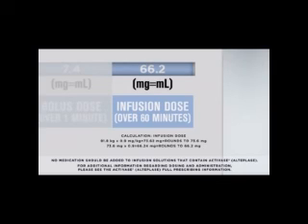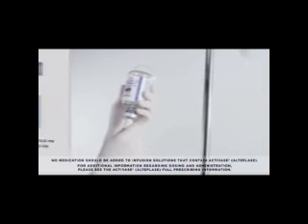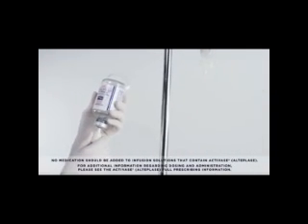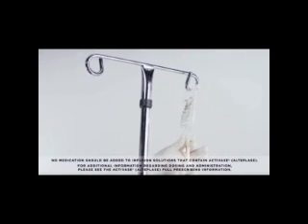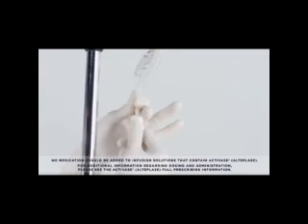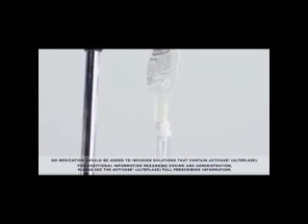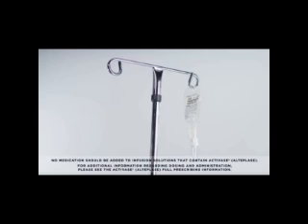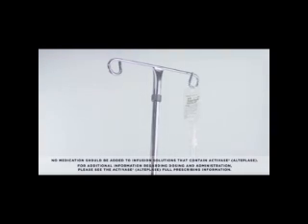In this case, the infusion dose would be 66.2 milligrams or milliliters. Lastly, to ensure the full dose is delivered, spike a small bag — for example, 50 milliliters — of 0.9% sodium chloride USP with the end of the Activase infusion set when the Activase vial is empty, and continue the infusion at the same rate.